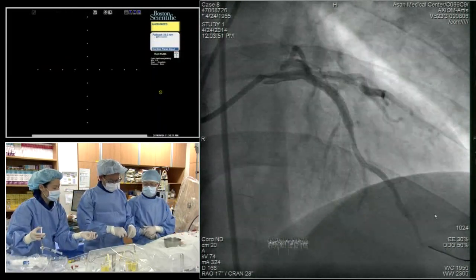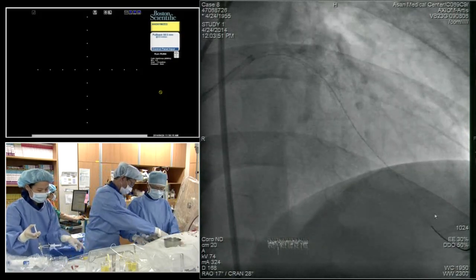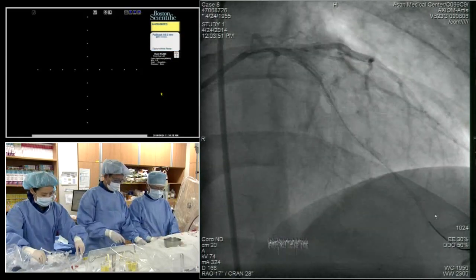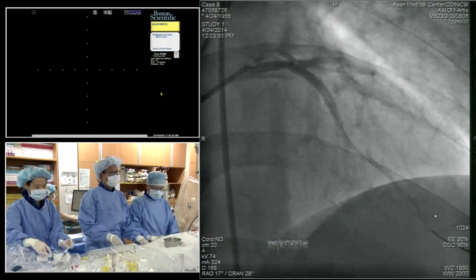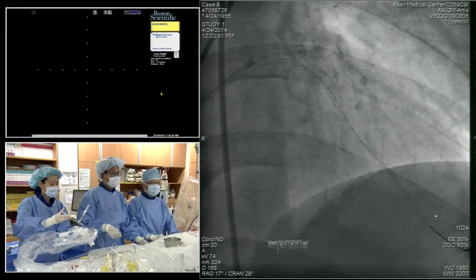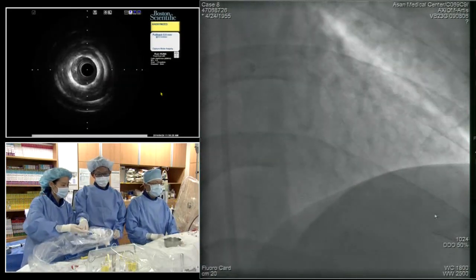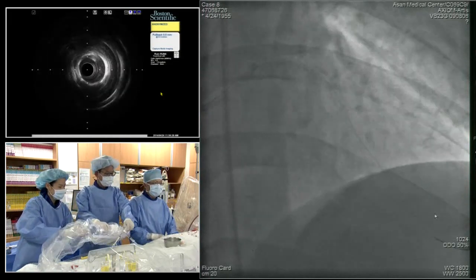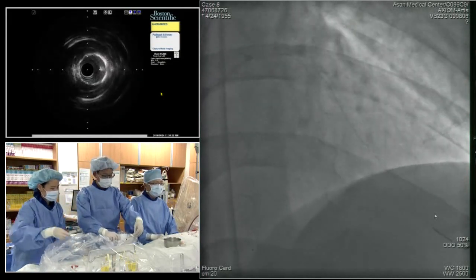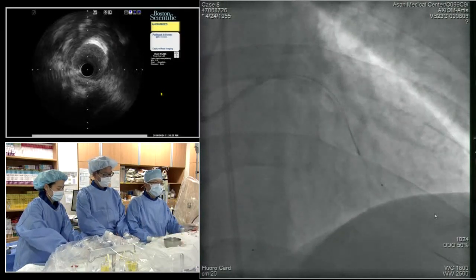Sometimes we skip it, but here I have Dr. Khan with me, which gives me even more confidence to look at how things look. So the question is, in this person, do we need to do anything to the right coronary? Is it something that we should bring back another day to open up the right, or should we check? Certainly wouldn't do it today. See how he does.